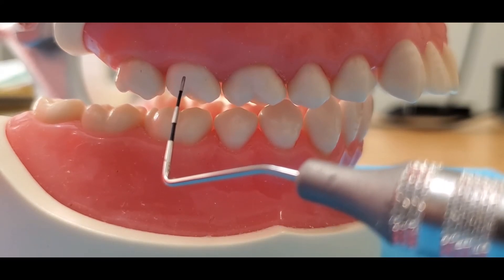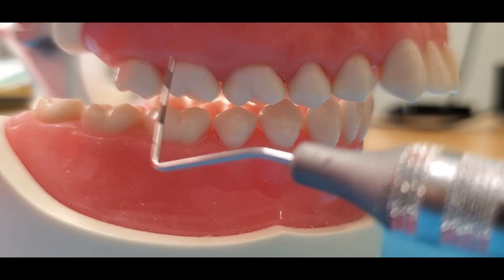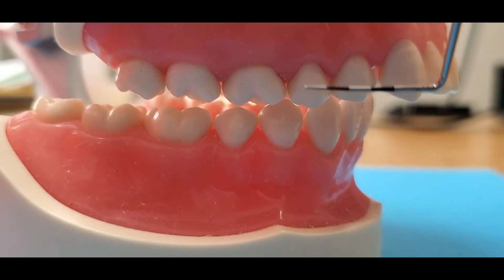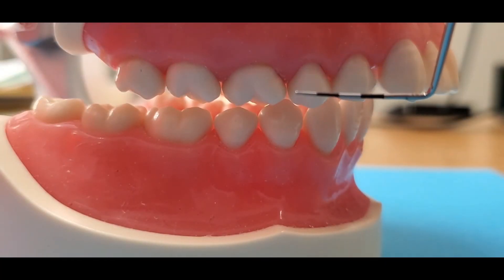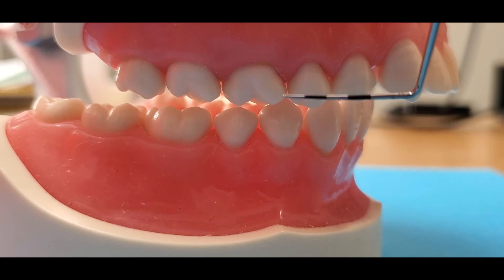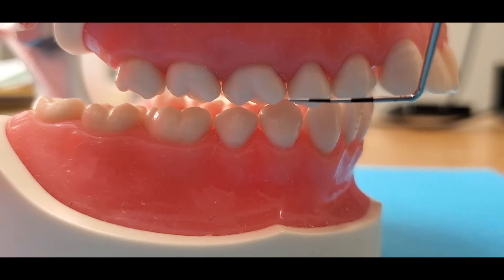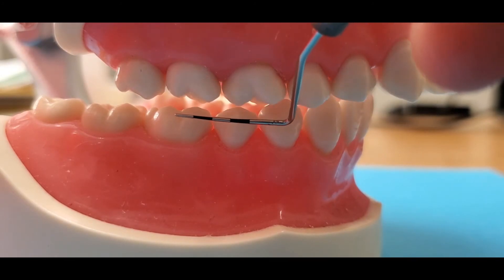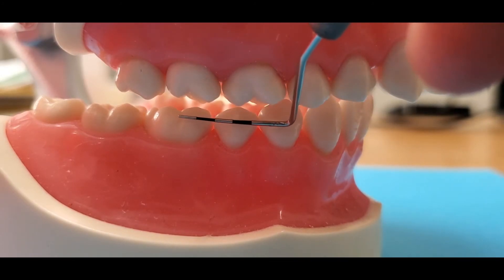Then I must ask: is it a true class 2? The way I do that, I would measure the width of the premolar. We've already done that and determined it's about 8mm.